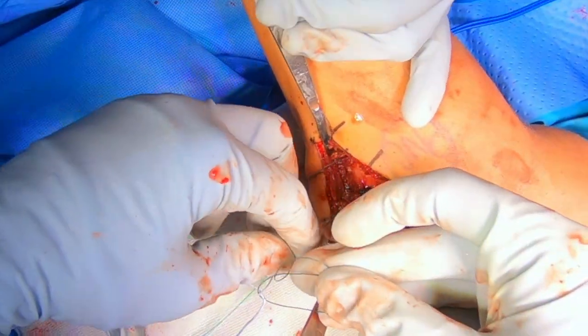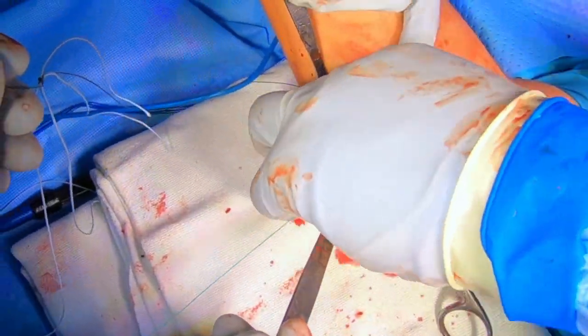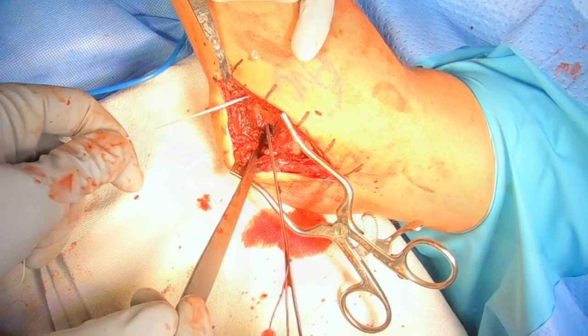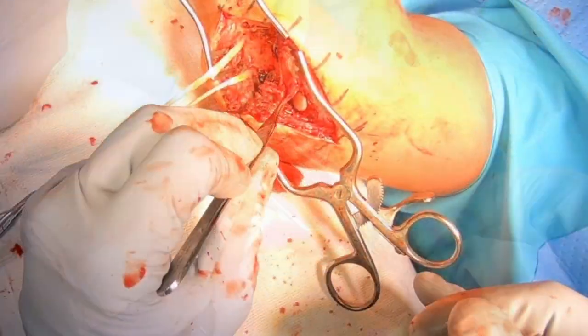Now I have one suture passing from one hole to the other. I use that suture to tie around the sutures that go into my graft and pull that through the tunnel. Then I pull the graft itself through the tunnel. Now I've got my graft lined up.